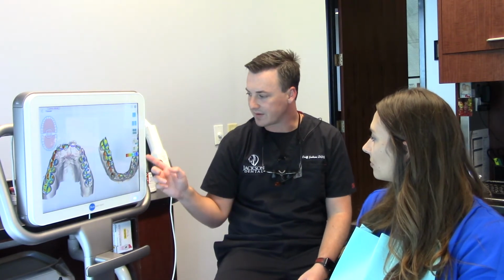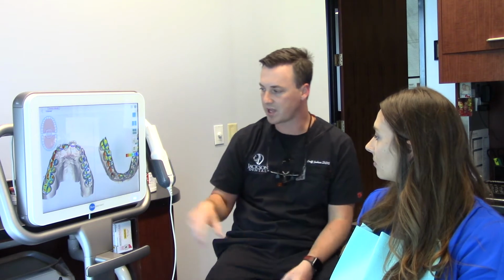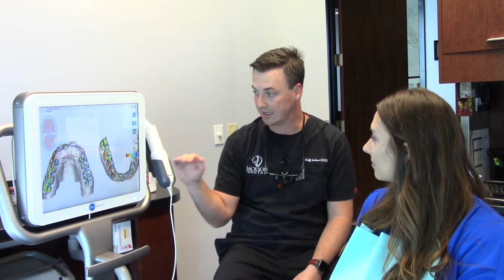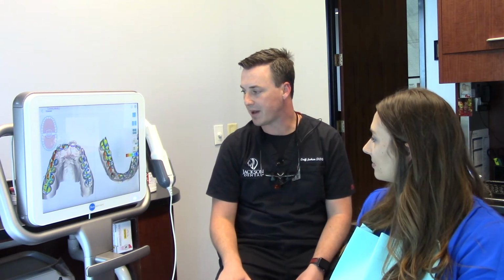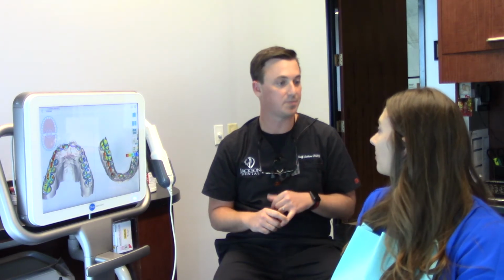The reason we're having this wear is because the bite isn't balanced. When the bite isn't balanced, you're crushing certain teeth and certain parts of the teeth. That's why you can already see the dentin, the inner part of the tooth, the yellow portion there, through. That's pretty premature for someone your age, so this is something we really need to think about correcting to avoid unneeded or unnecessary dental treatment and dental expense.